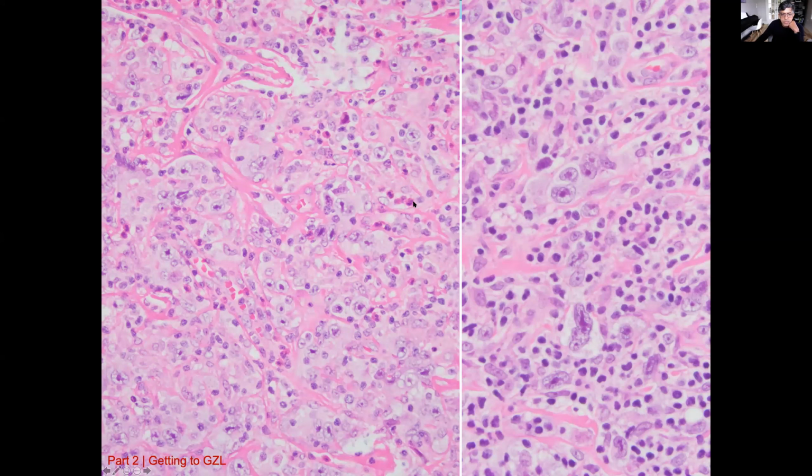There are eosinophils, so the environment seems perfect. Yeah, so far so good. And maybe in those 4 boxes that we had, nodal sclerosis seems reasonable. But again, you do need immunostains to get to a diagnosis here. So let's see how we are on time. 9:36, so we're not too bad.